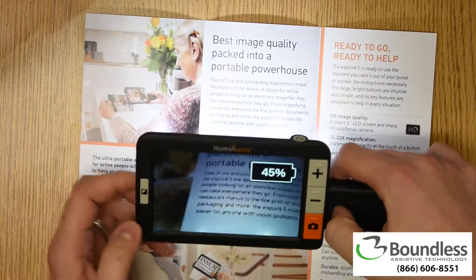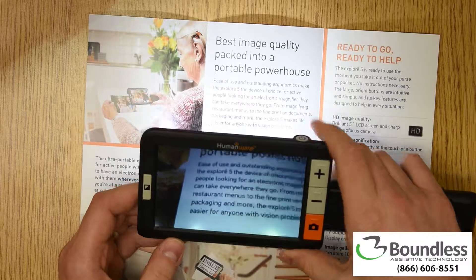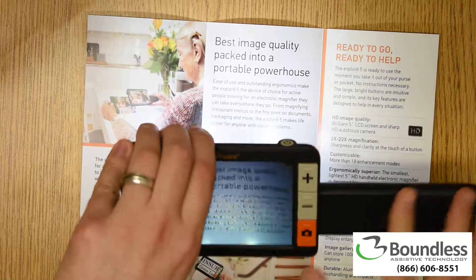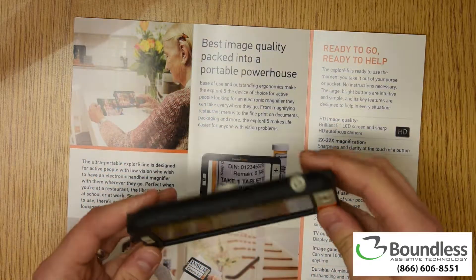That's another cool thing — it actually turns on instantly as soon as you open up the handle, so I can hold it and use it this way. The same handle also folds back underneath the device and it turns off as you see.